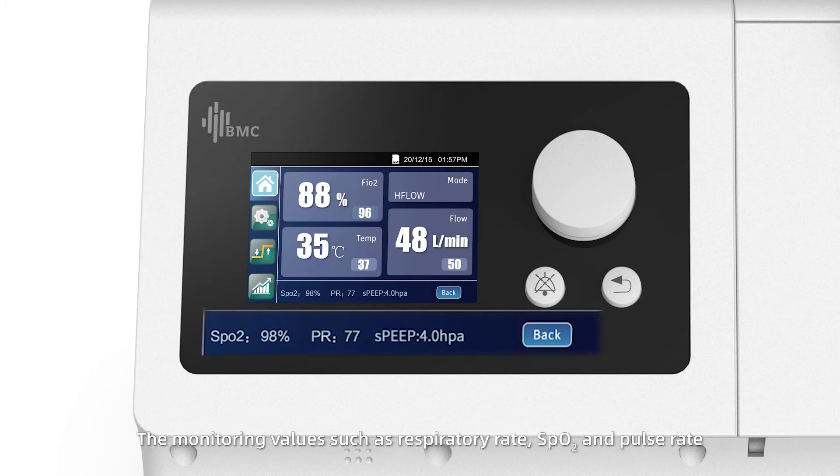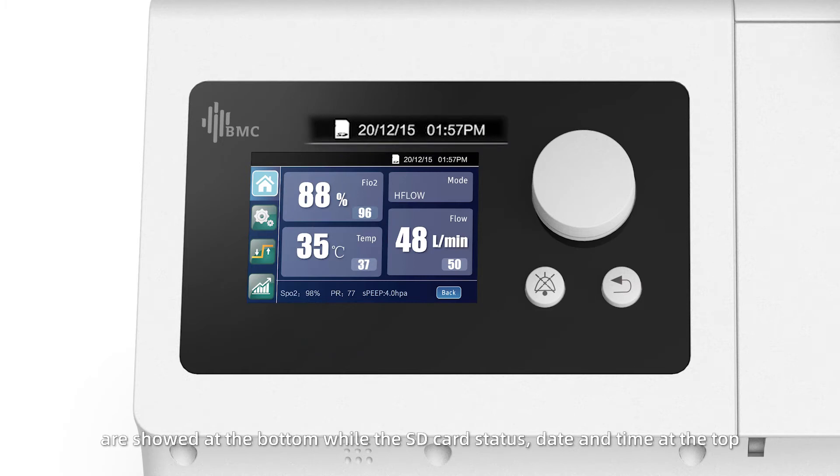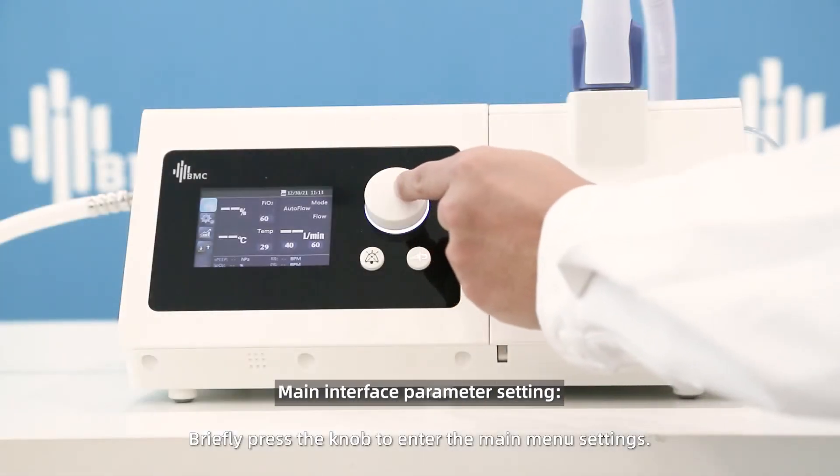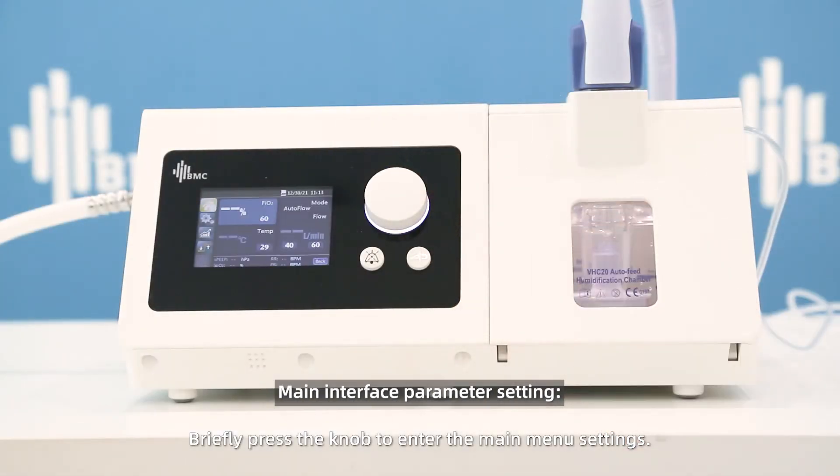The monitoring values such as respiratory rate, SpO2, and pulse rate are shown at the bottom, while the SD card status, date, and time are at the top. Briefly press the knob to enter the main menu setting.